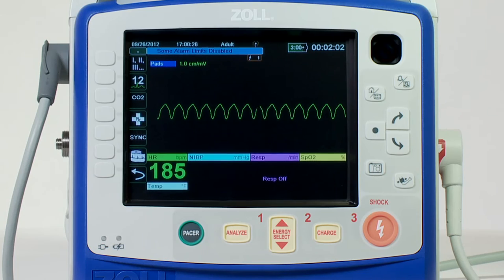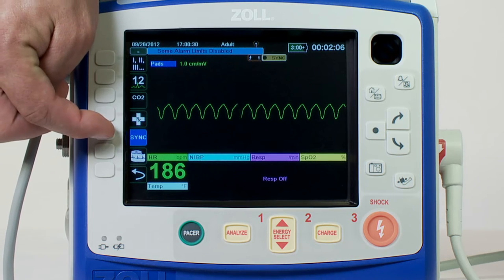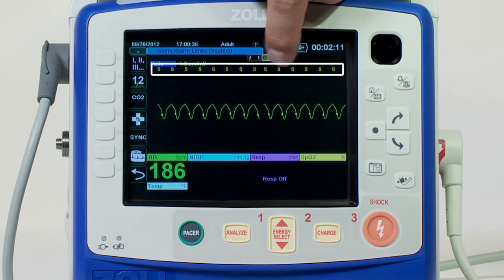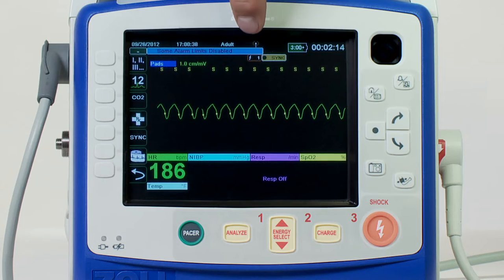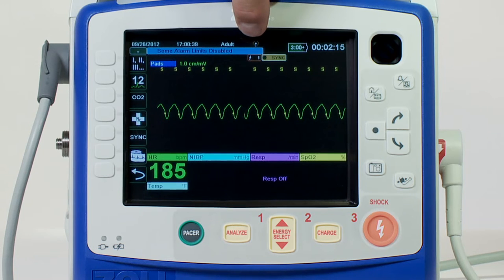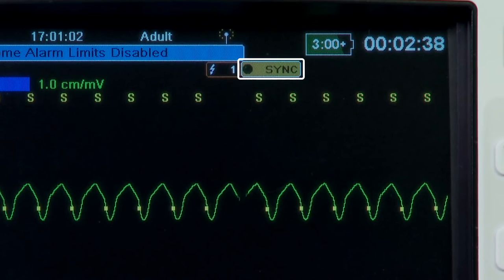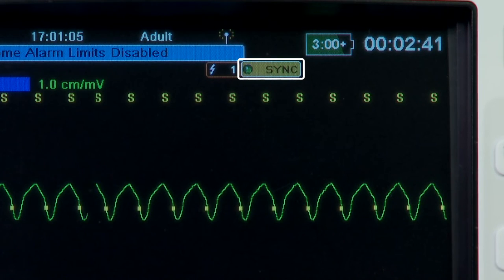Press the sync button on the front panel; the system will now be in sync mode. A sync marker appears on the monitor above each detected R-wave to indicate where discharge will occur. A sync indicator appears at the top of the display screen, and a green light next to the indicator flashes with each sync marker.